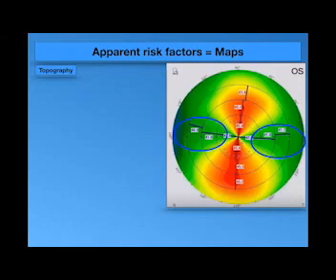But when you have any topography or the Pentacam maps, you have to check first the reliability of this test, if it's reliable or not. If the patient acquisition is good or not. The first point to start studying it, to be sure that it's reliable. Otherwise, you will ask for recapturing again. If there is misalignment, if there is deviation of the eye, if the patient is not concentrating properly on the target point in the device, you will check all of that to get reliable.